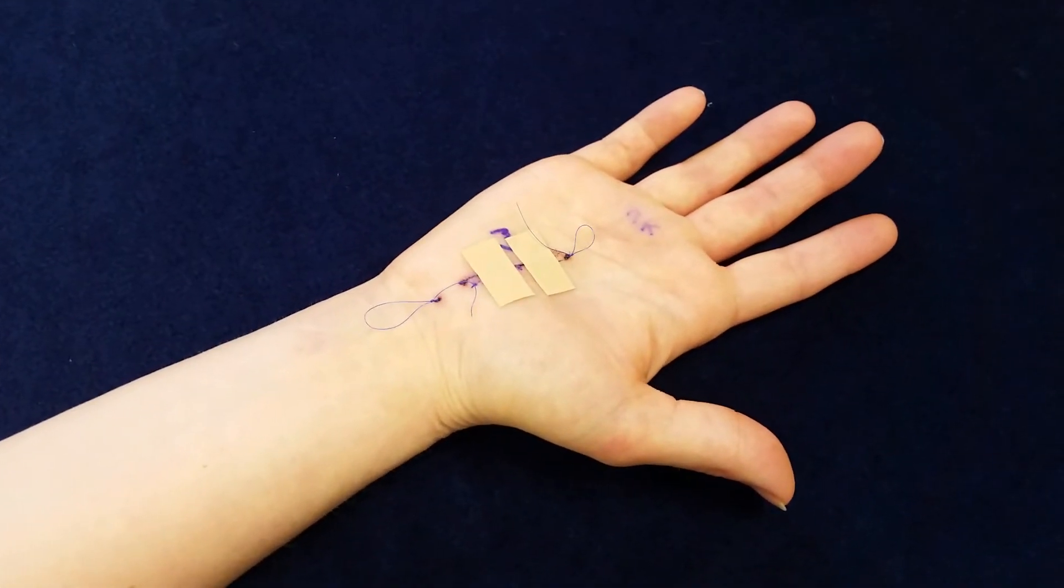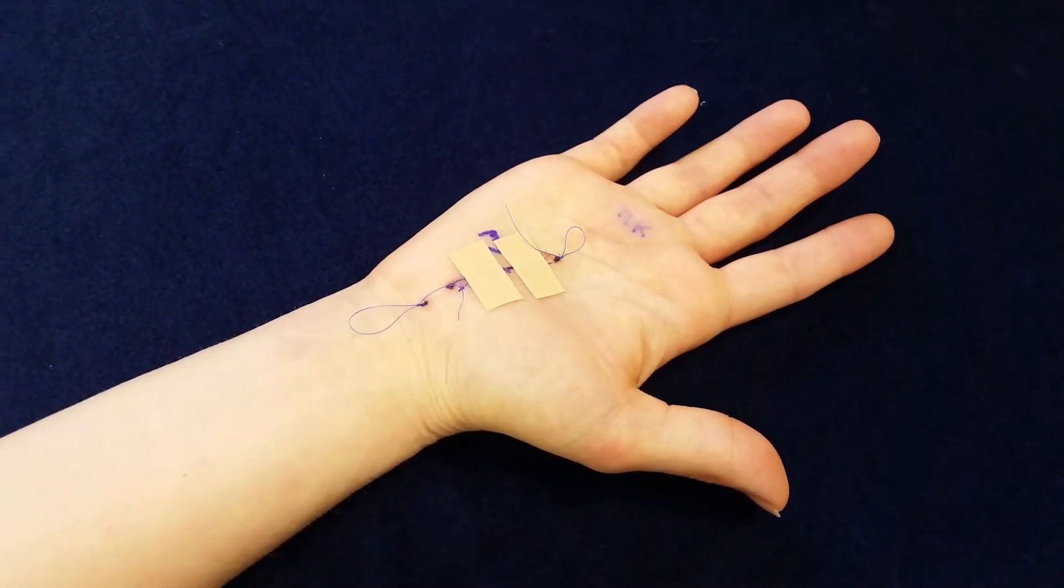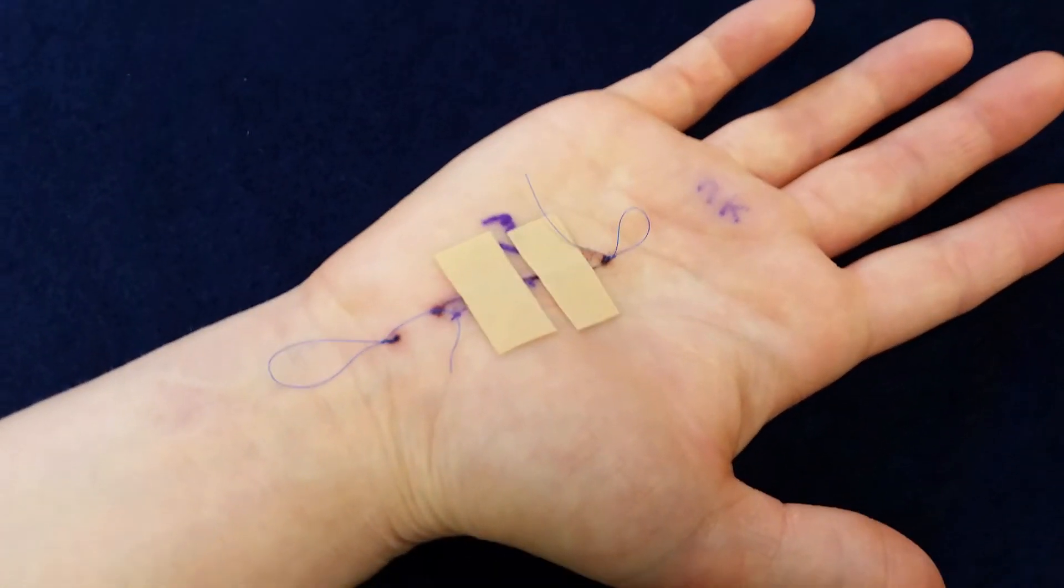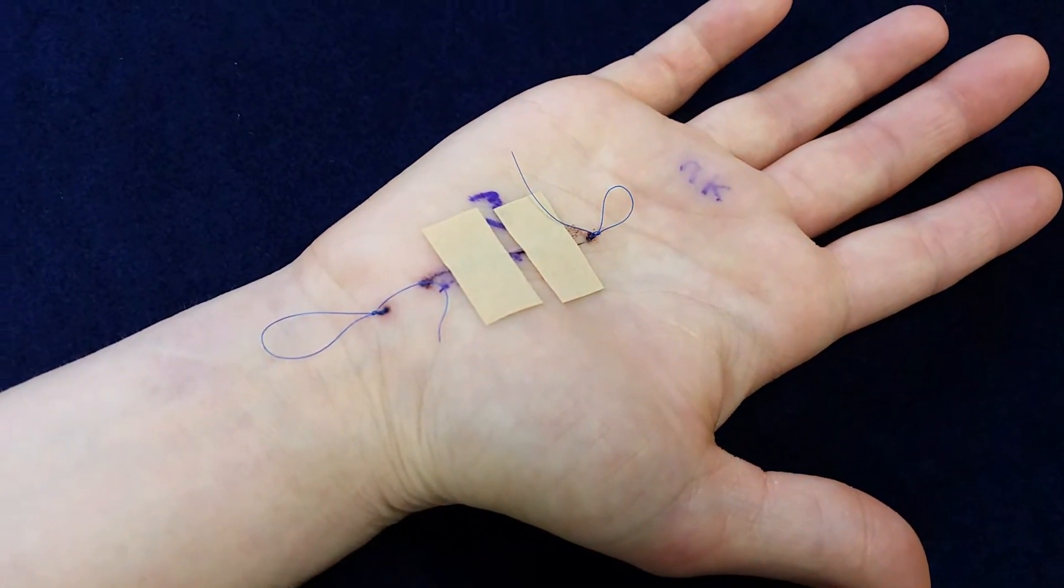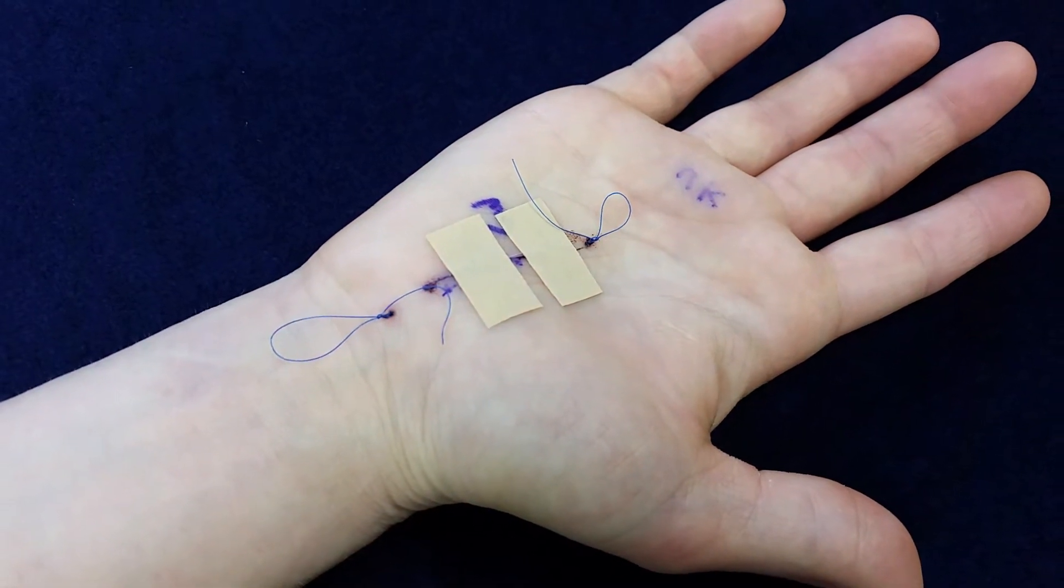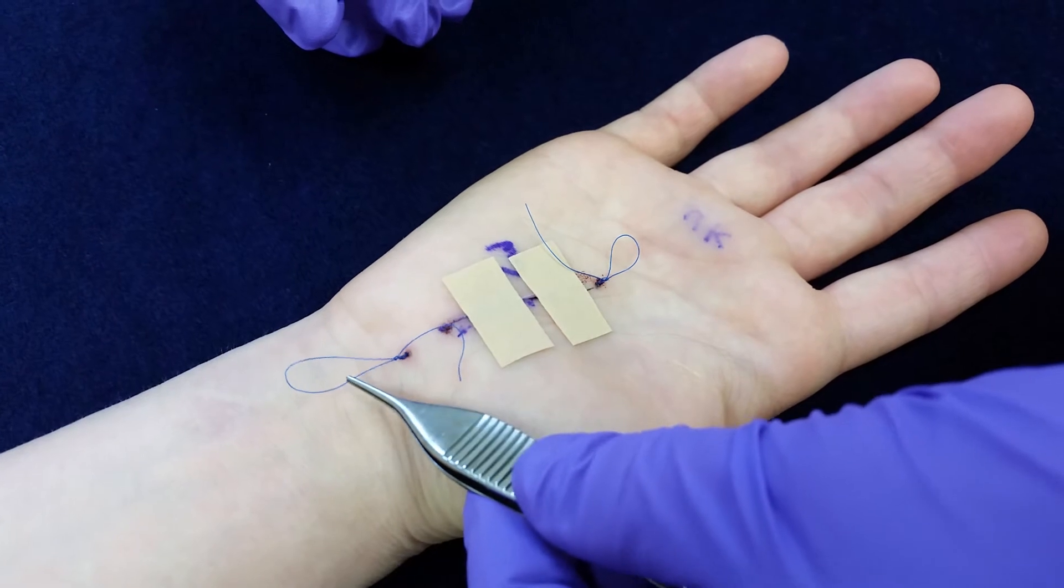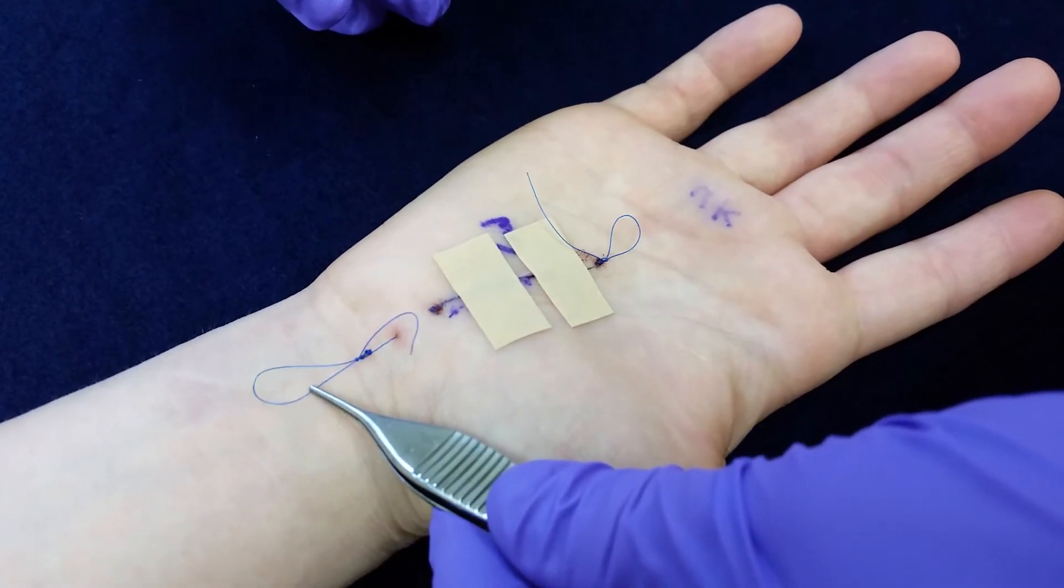So here we're going to demonstrate how to take out a running subcuticular stitch from a carpal tunnel incision. What you'll see is that there is a loop on either end, and what we're going to do here is we're going to take our pickups and pull the loop a little bit away from the incision line.